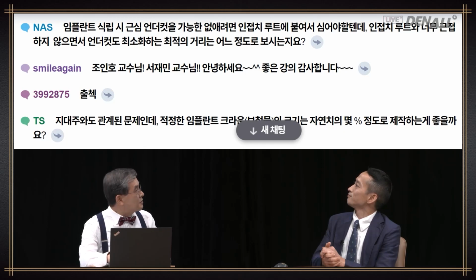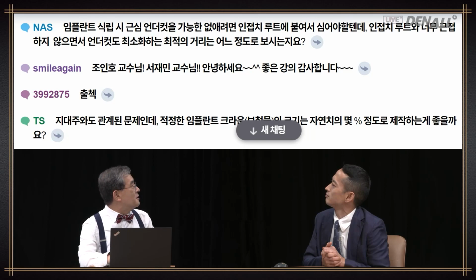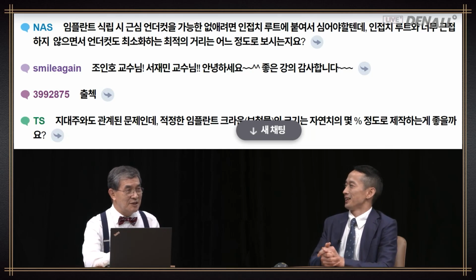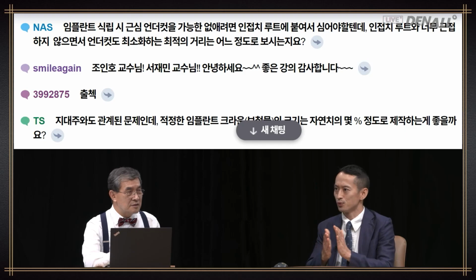Thus, when placing an implant, in order to minimize mesial undercut, you need to place it as close as possible to the adjacent root. What is the optimum distance which does not get too close to the adjacent root and minimizes occurrence of undercut? So the distance when you place the implant. It's very difficult to pinpoint a number. I tried to place it close rather than apart.